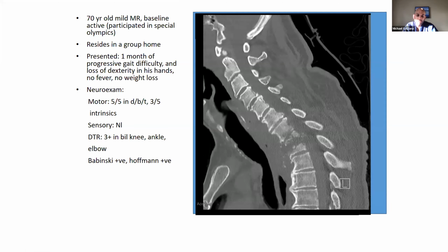Based on what I see here, I would probably advocate for doing this all posterior. I would do a posterior VCR, a T1 and T2, and then long segment fixation. I might try to put a cage in. Because this is an infection case, I'd probably try to stay away from cement. For some of these tumor cases, I like to utilize Kyphon cement. It gives a fairly large footprint. You don't have to muck around with the cage around the nerve roots. But in this situation, you could probably cut the T2 nerve root, T1 nerve root I would spare. That end plate's a little bit concerning there. I'm not sure if you'd be able to get a cage to sit on that, but I'd like to get some kind of strut in there, and then long segment fixation fusion from the back.